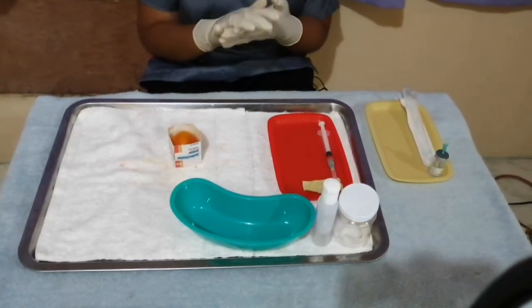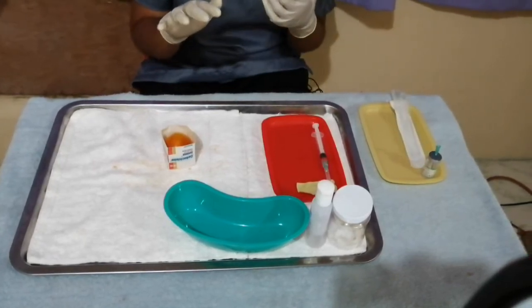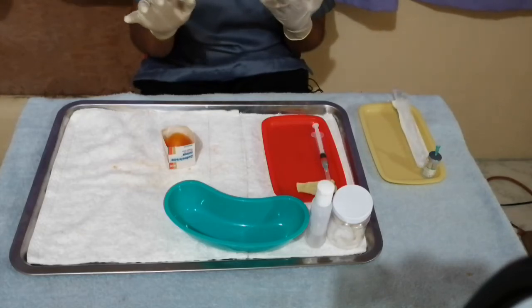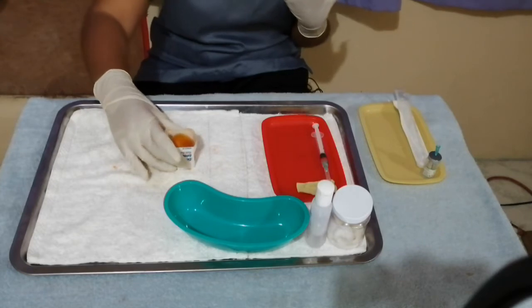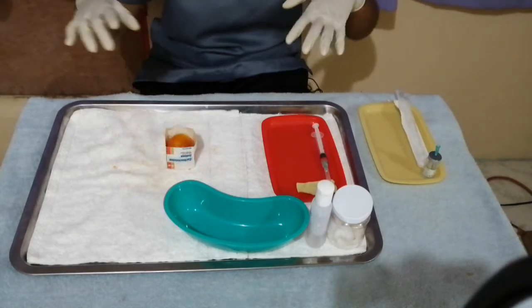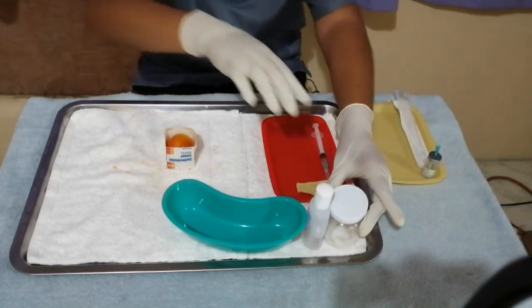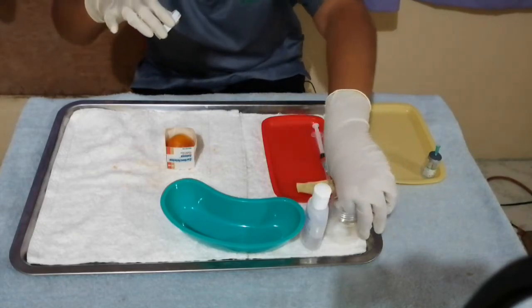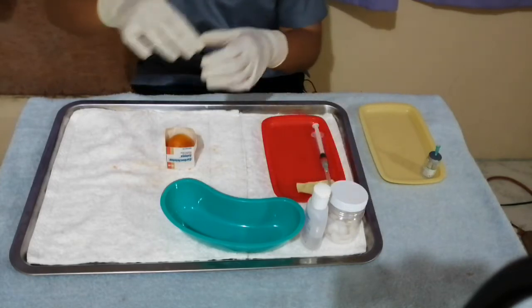After that, we're going to select the appropriate injection site and locate the site correctly. Assuming that we already have the site for the injection, next we're going to cleanse the site with cotton balls with 70% solution alcohol, in a circular motion moving outward.